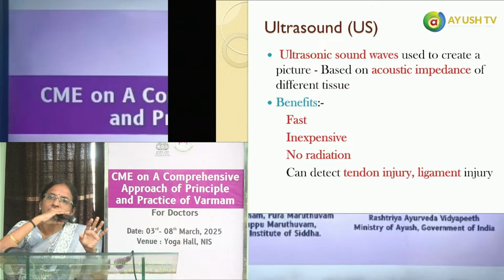இதுல வந்து அல்ட்ராசவுண்ட் வேவ்ஸ். ஸோ அல்ட்ராசவுண்ட்னா நம்ம இயர்ஸ்ல ஆடிபிளா இல்லாத ரேஞ்சில் இருக்கிற சவுண்ட் வேவ்ஸை we will pass through the body and that tissues in the body பாதி அப்சர்வ் பண்ணும், பாதி அதை ரிஃப்ளெக்ட் பண்ணும். That is called as acoustic impedance. So based on the acoustic impedance of the different tissues, we will get ultrasound pictures.